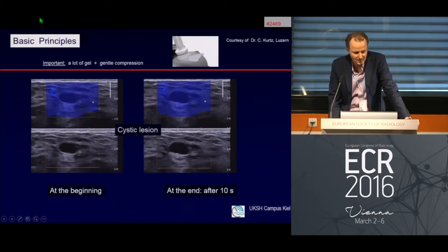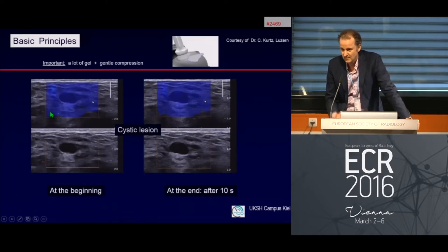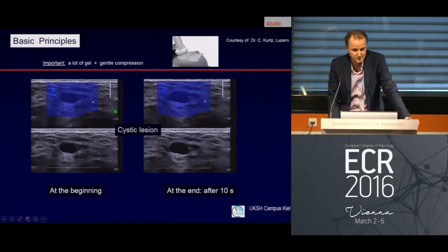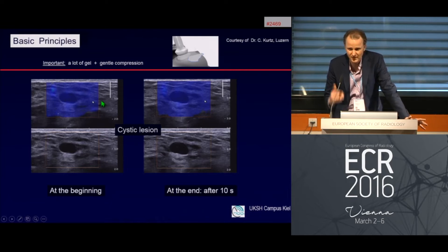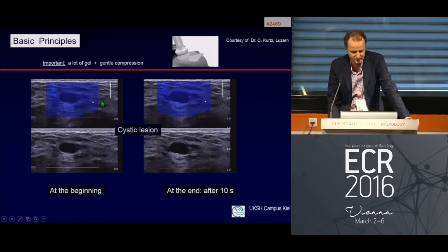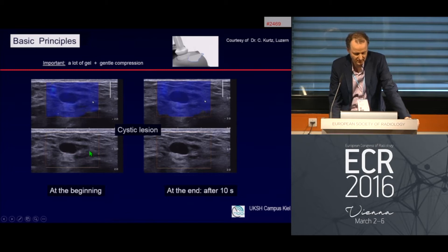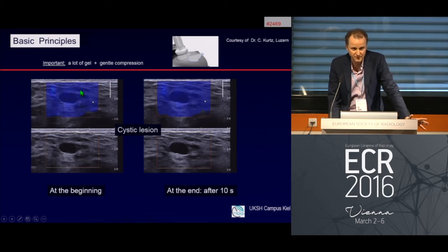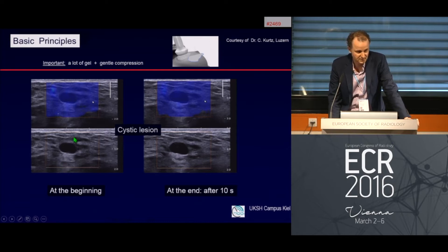Basic principles: first, you need a lot of gel — really a lot — and only very gentle compression. This is very important. For a cystic lesion with an anechoic appearance and dorsal enhancement, the image appears overall blue, indicating a very soft, homogeneous, benign area. The appearance is stable: it looks the same at the start as after 10 seconds.